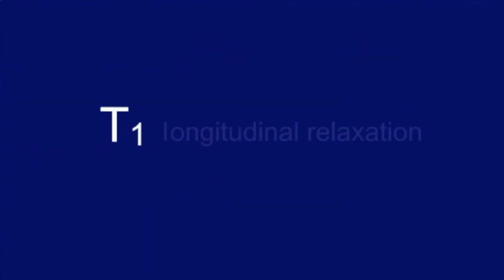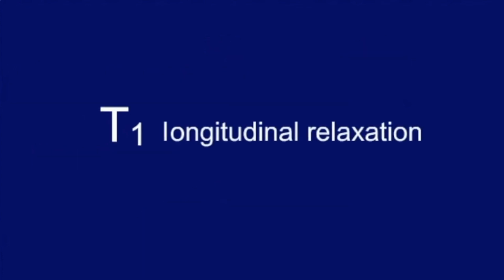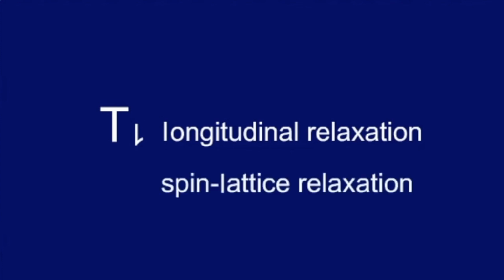That T1 is the longitudinal relaxation time can easily be remembered. If you turn the 1 upside down, it looks very much like an L, as in longitudinal, reminding you also that it describes the spin lattice relaxation.